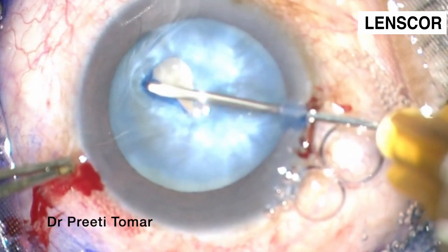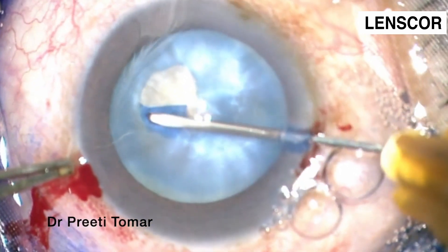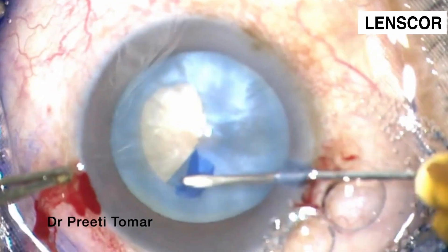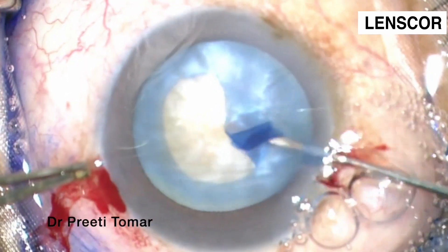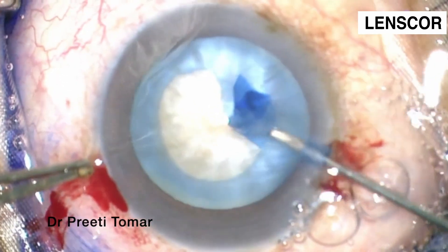I have begun my capsulorrhexis with a deliberate puncture of the anterior capsule with the help of a cystidome. One should note that the vector force applied here for the capsulorrhexis tearing is directed parallel to the direction in which the tearing is required. This type of tear proceeds slowly and can be easily controlled.